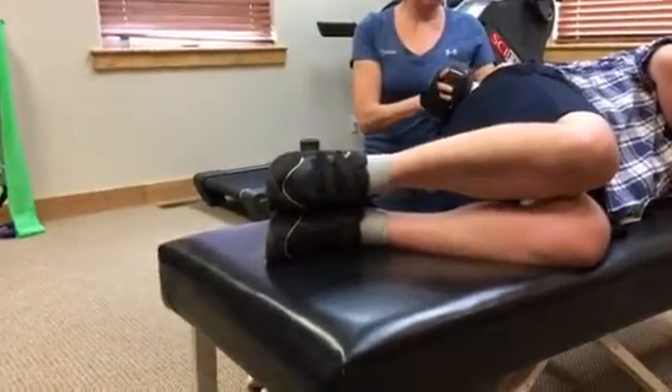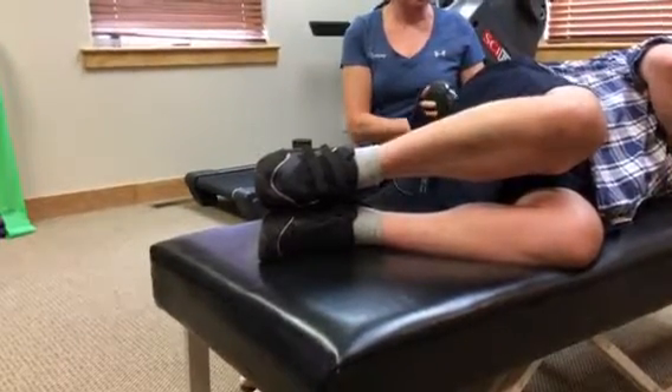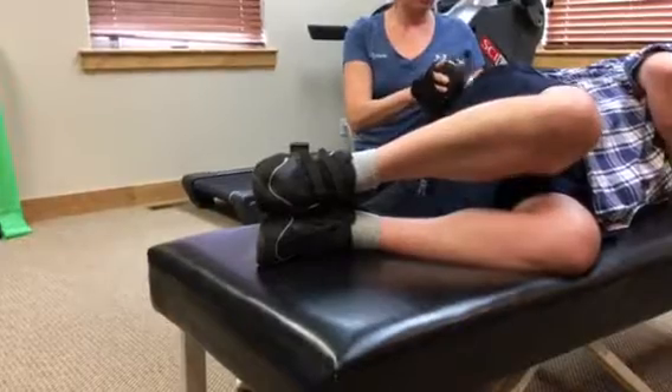What we're doing is we're doing a quick stretch to that muscle and we're applying feedback all the way up and down the nerve pathways to the brain.